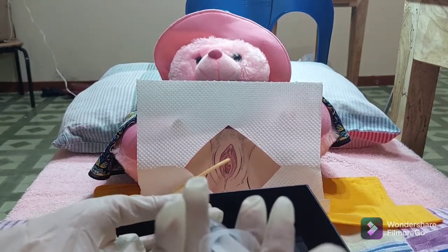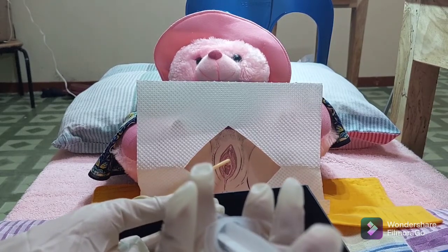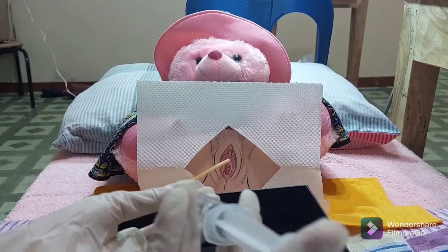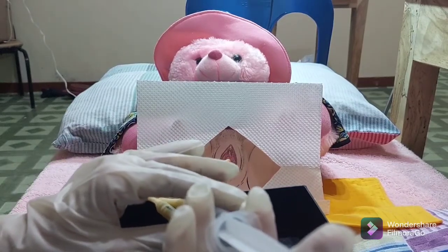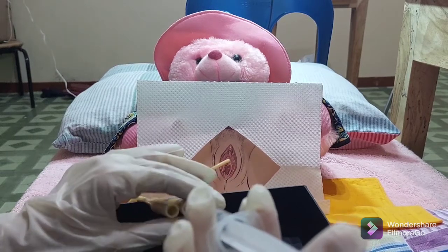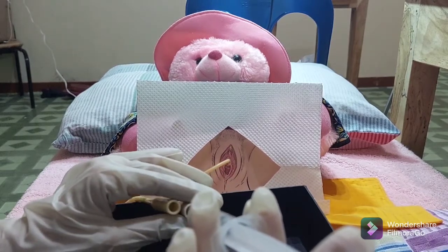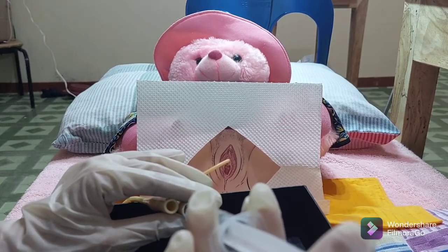Slowly inflate the balloon for indwelling catheters according to catheter size, using the prefilled syringe. The size of the balloon is marked on the catheter port. Note, if the patient experiences pain on balloon inflation, deflate the balloon, allow urine to drain, advance the catheter slightly and reinflate the balloon.